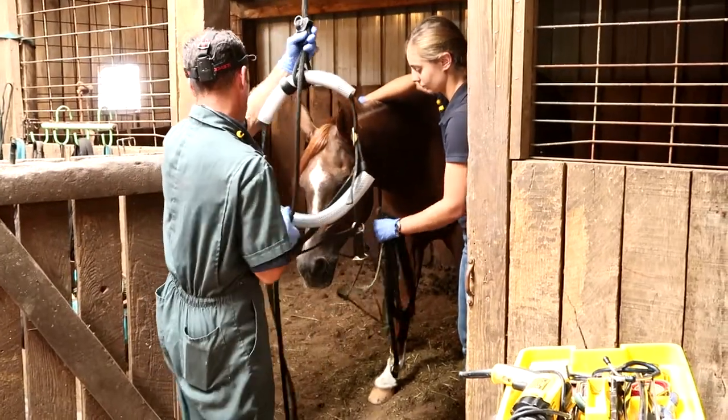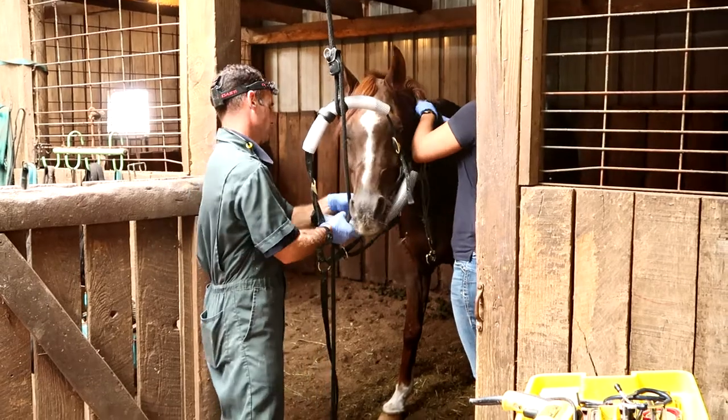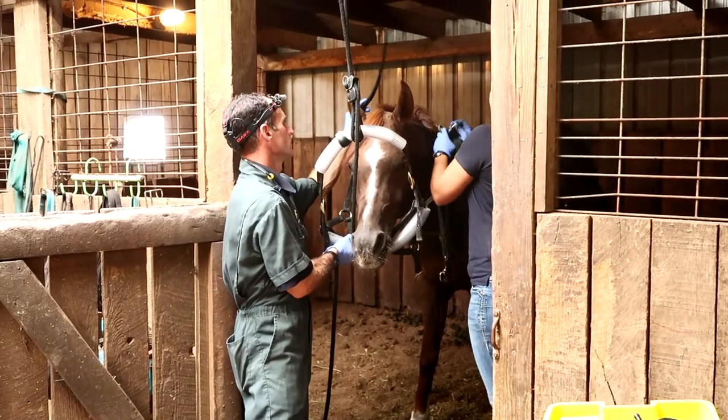The little halter here that they're using is a pulley halter so that Dr. Scott can raise or lower Tino's head depending on where he needs to look in his mouth.